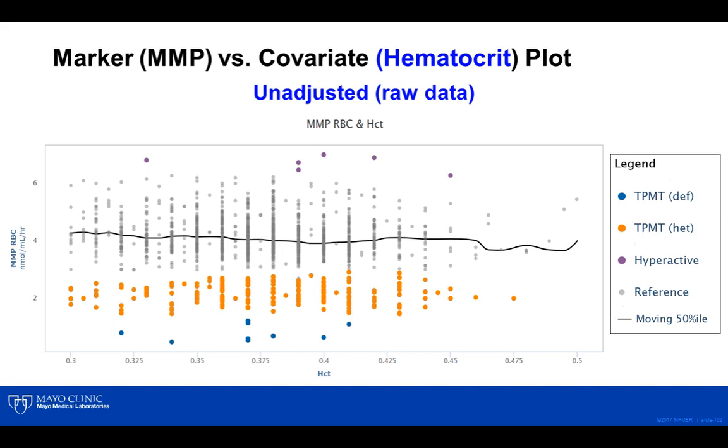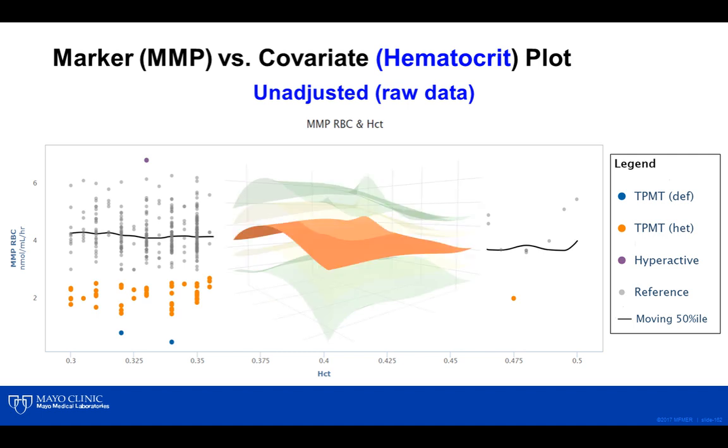Finally, another continuous covariate that could be factored in is the hematocrit. The value of adding a second continuous covariate could be found once sufficient data becomes available, in the opportunity of creating tridimensional reference ranges, like the example shown here. This plot shows the median, orange plane, plus and minus 1 and 2 standard deviations of the amino acid phenylalanine in dry blood spots, adjusted simultaneously for two continuous covariates, age of collection and birth weight. The count of data points exceeds 1.2 million.